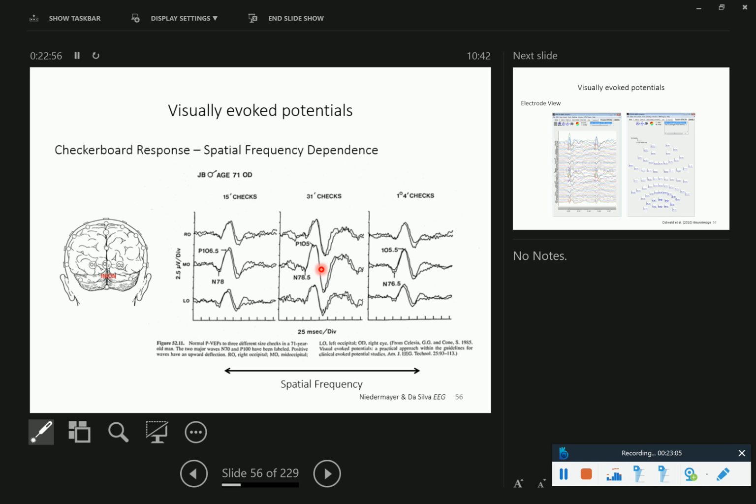So in general, if you do a cognitive study, for example, now that we are doing decision from experience more with EEG, where we present numbers, actually the first thing that we presented were also checkerboards, but now using more abstract stimulus material, of course, we know that if we would just present a checkerboard, we get some response. So you should factor in somehow visual responses to stimuli, which can, however, vary depending on the stimulus material, as we have already seen.